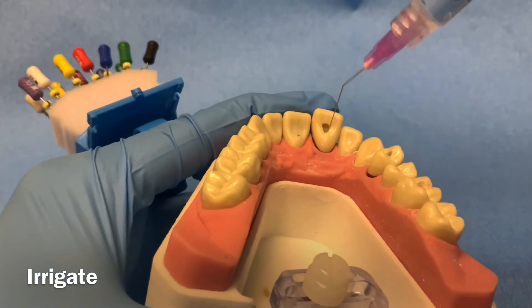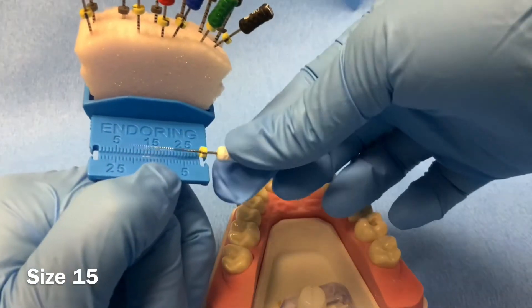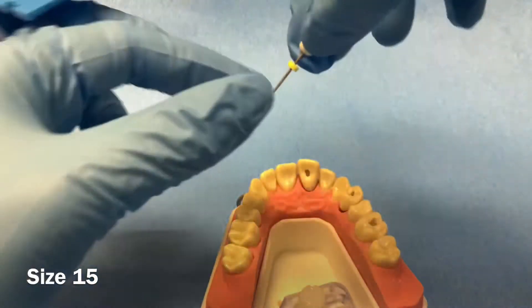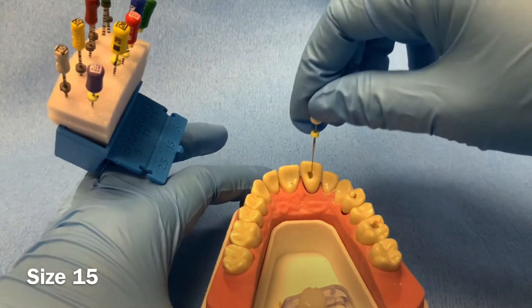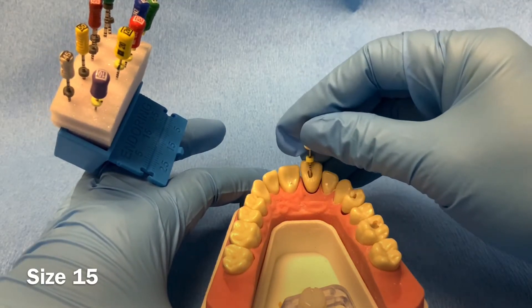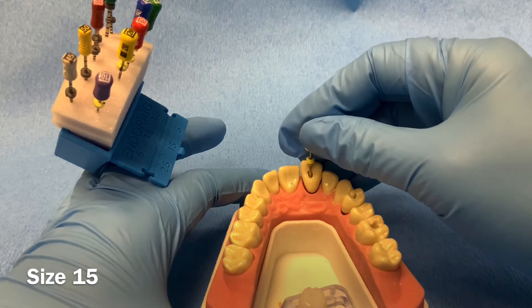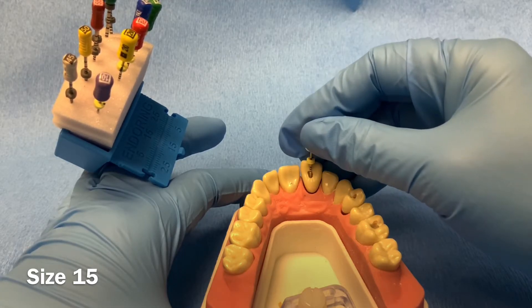Irrigate the canal using water, then adjust the rubber stopper on the size 15 k-file to your working length. Clean and shape the canal using the quarter turn in and pull motion until the file has minimal resistance in the canal and reaches the working length as indicated by the rubber stopper on the file.